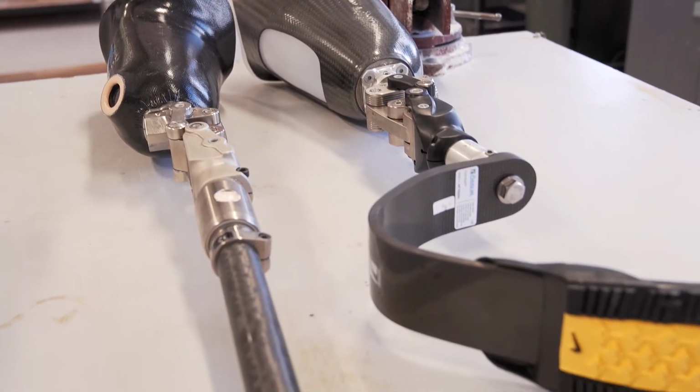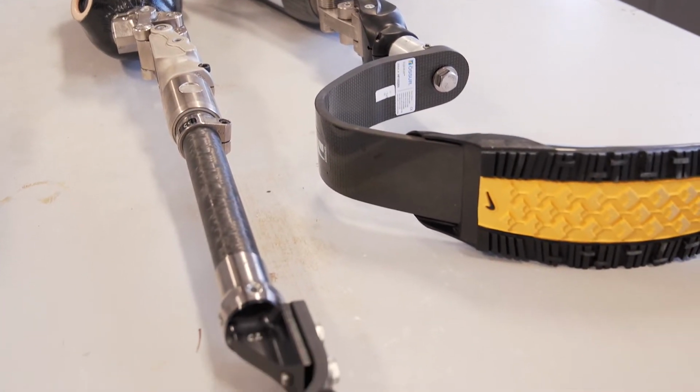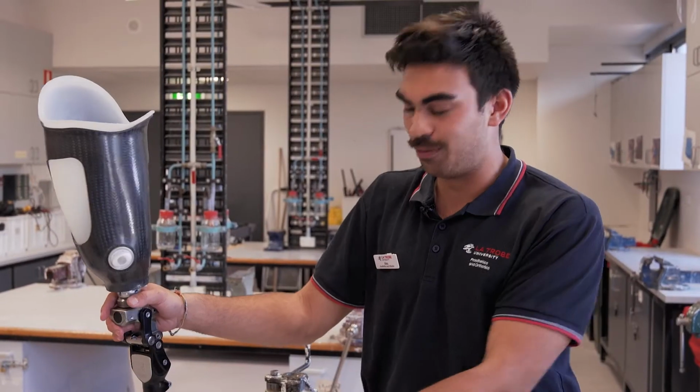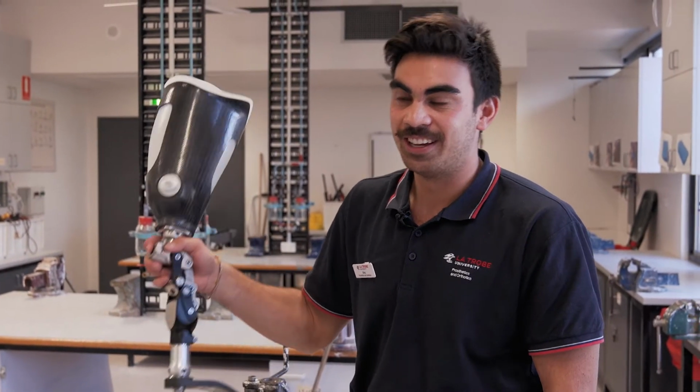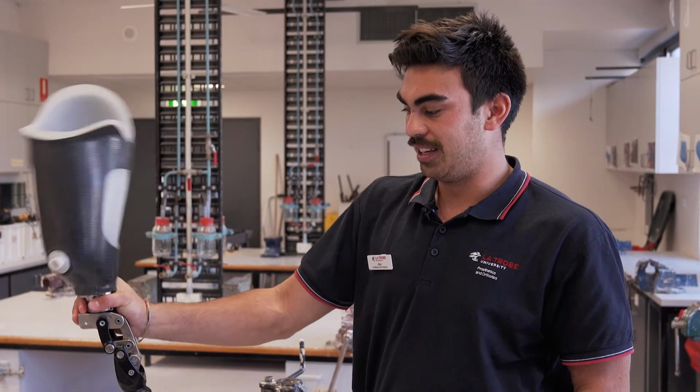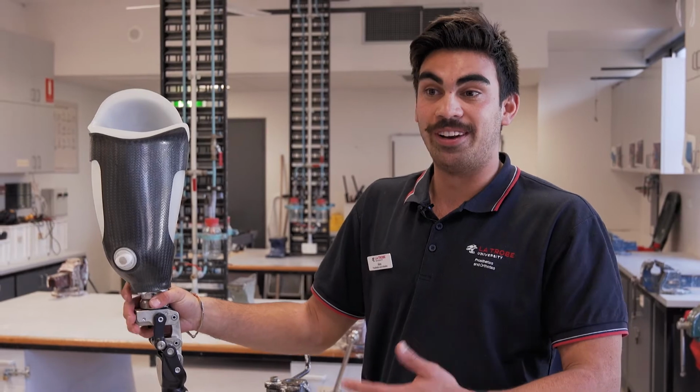Most importantly, before you get to this stage, you have to figure out what the patient wants, like what are the goals? Because if they don't want to run, why would you give them a running leg? Or if they just want to be stable, why would you give them this multi-axial knee? Because it's not what they want. Understanding clients' needs is probably the absolute most important factor of our job here, because whatever we build them, they're only going to wear it if it's going to work for them with what they need to be able to do.